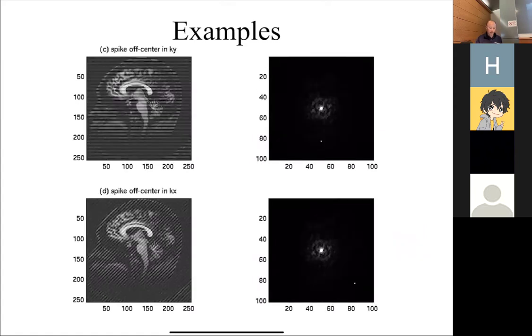So here's some interesting things. These are just synthetic examples, but occasionally we do see these in MR, and these are what are called corduroy or zebra artifacts. Occasionally there will be some energy or noise that gets into the system, either because there's a problem with the shielding of the room, or because MR is super sensitive. Even two pieces of metal hitting each other really lightly can create enough RF energy to create a spike.